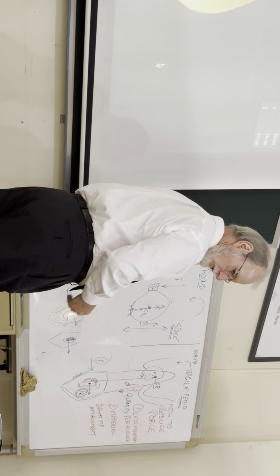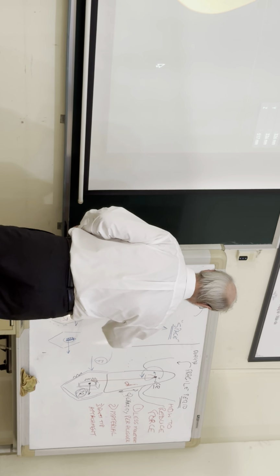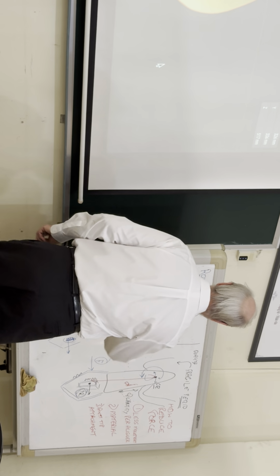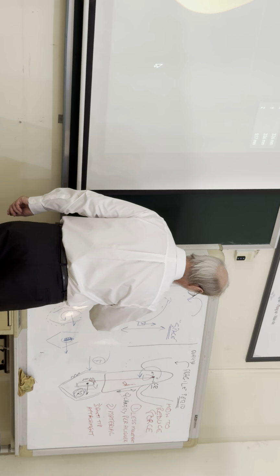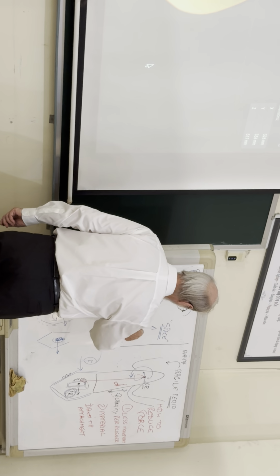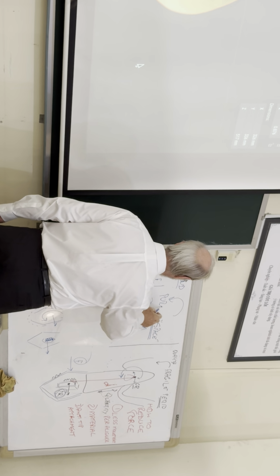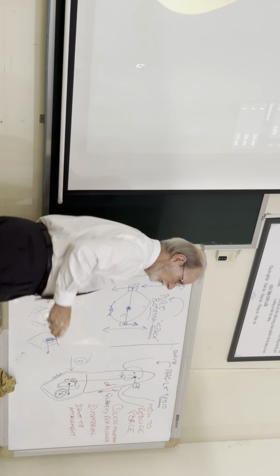That's pretty cool. So the tooth is staying where it's supposed to be. That's kind of nice. It's not moving. And what else do I get? Well, this thing is at D. I'm going to get a rotation here. And this guy is here. I'm going to get a rotation here. So basically, I get what we call pure rotation. That's what you need to do with aligners if you want to succeed. It's that simple.